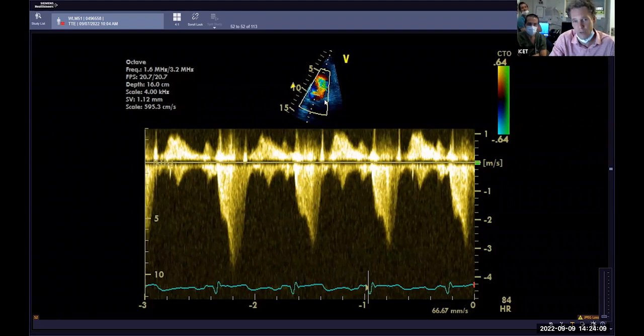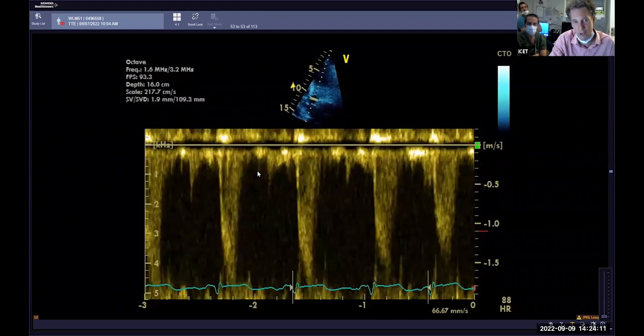So what we can do then is use pulsed wave Doppler, and here's pulsed wave Doppler. I know it's pulsed wave because you've got two little lines in there, a gate, and the hole in the middle looks black. But the bad part is it can't give us high gradients. So here it's going up to 1.5, and you can see it's aliasing, the profile is coming off the top and wrapping around from the top.